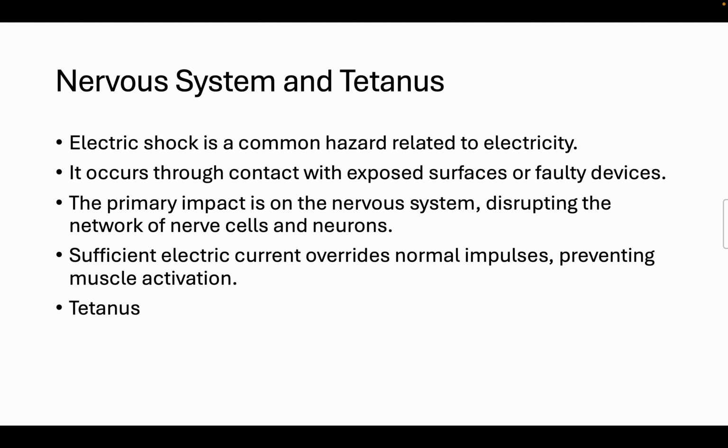Why? Because of the electrical current conducted through the person's arm, the bending muscles will win, and this clenches the fingers into a fist. And of course, this is very dangerous because it only takes a small amount of electrical current to cause heart failure.